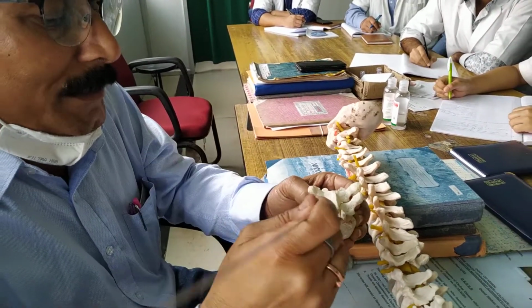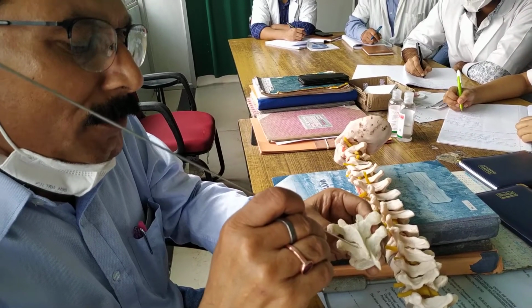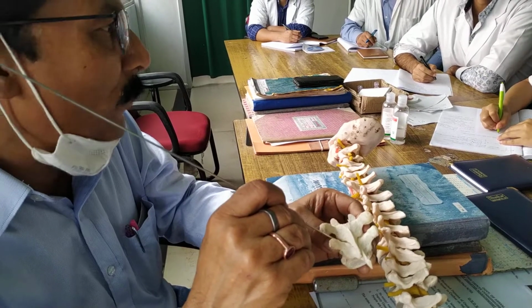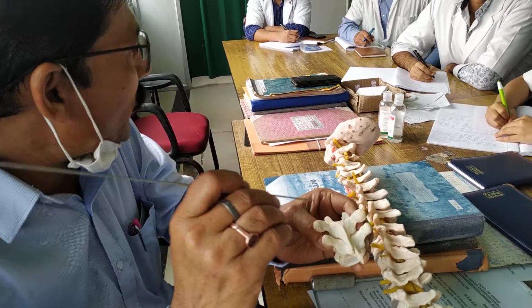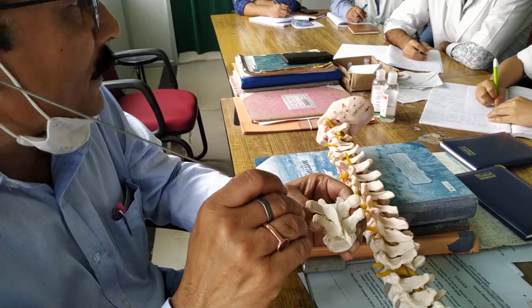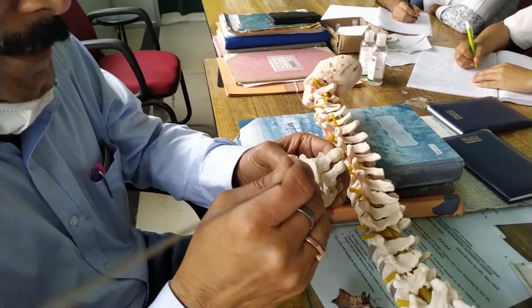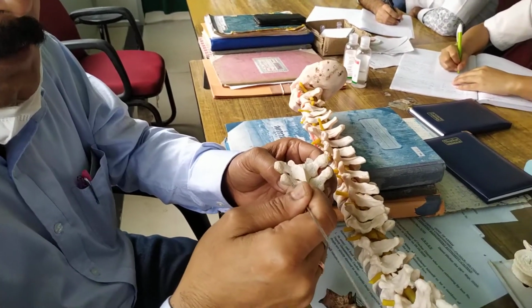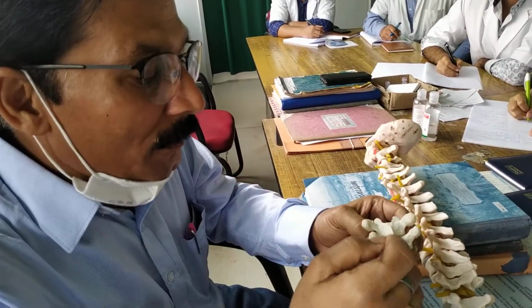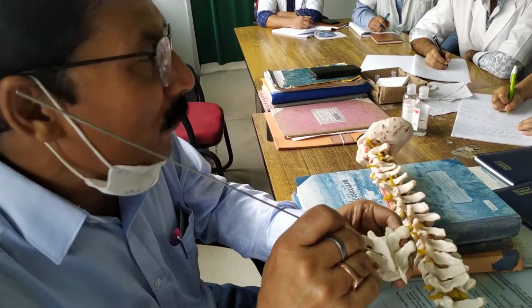Now, next point is how to find them. See, if you are doing dissection on the lamina and you go above, you will find this joint over here. It is almost mandatory always to find the joint. Since the joints are overlapping each other, you have to dissect and find out the border. Then if you go laterally, you can find the transverse process easily. But this joint is not very easy to find. So you have to do the dissection and find the joint over here.